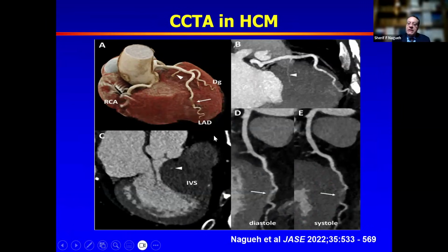And that is nicely illustrated here with that arrowhead. Also, these patients can have myocardial bridges, as you see here. These vessels, the left anterior descending artery segment within that bridge, gets compressed during systole and can be a contributor for symptomatic problems for these patients. Some surgeons will relieve that bridge obstruction.